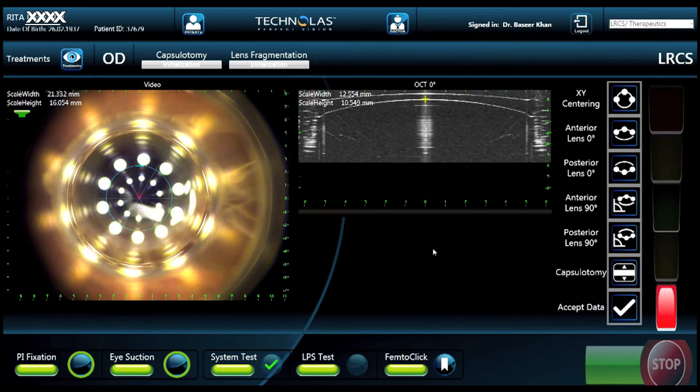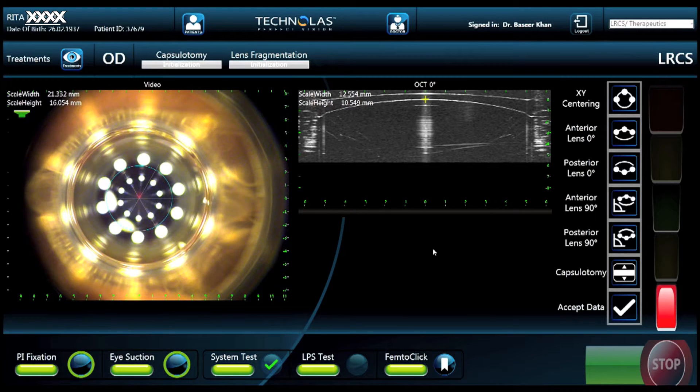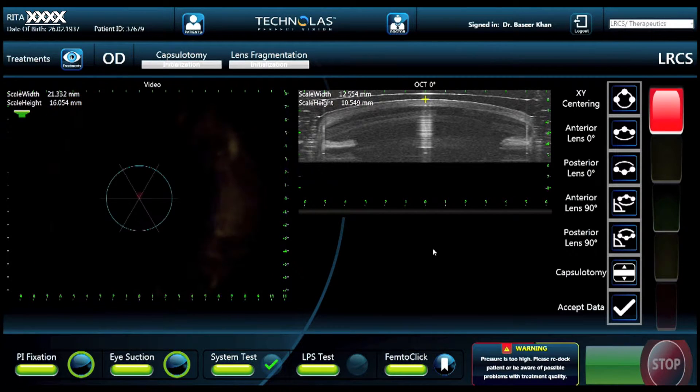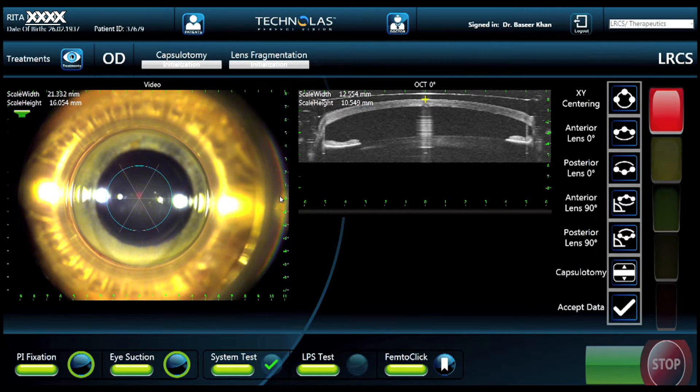Eventually, as there's contact with the surface of the cornea, the fluid that's been placed on the cornea gets pushed away. We're going to overpressurize the docking mechanism against the eye to get rid of the bubbles. Once the bubbles are gone, we're going to ease back on the pressure, as you can see on the gauge on the right-hand side of the screen.